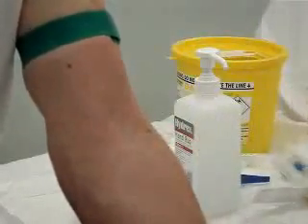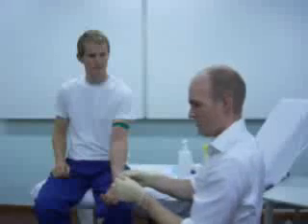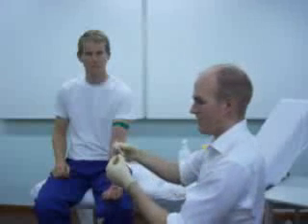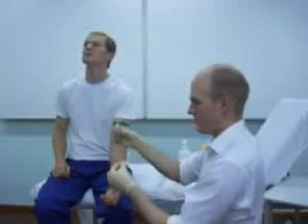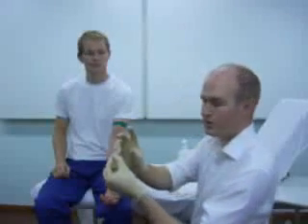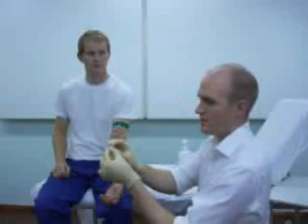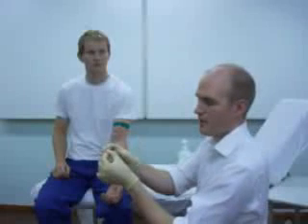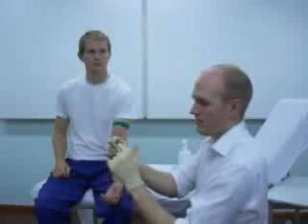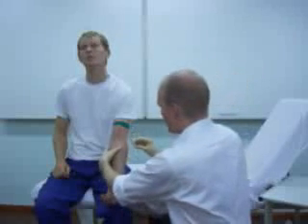Now I've got a clear idea of exactly where I'm going to go. Open the venous cannula, and it comes out like this with the two wings that need to be bent sideways, a protective plastic guard over the top. So take the protective guard off. The easiest way to hold the cannula is with your middle finger on one of the wings, index finger just around the cap, and thumb behind this supporting structure just here.